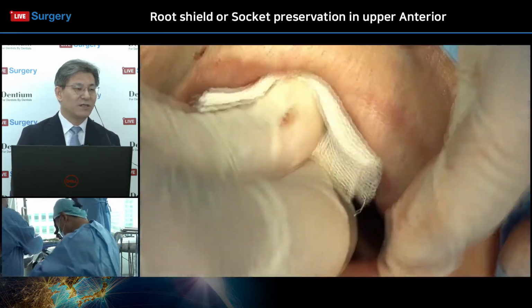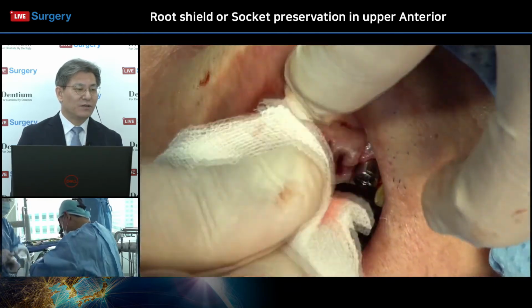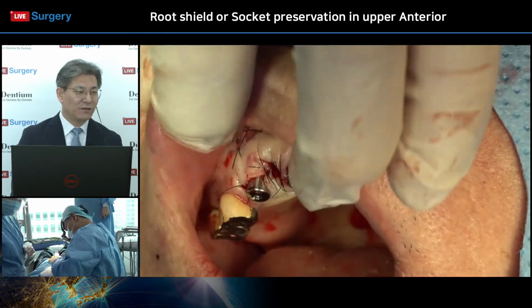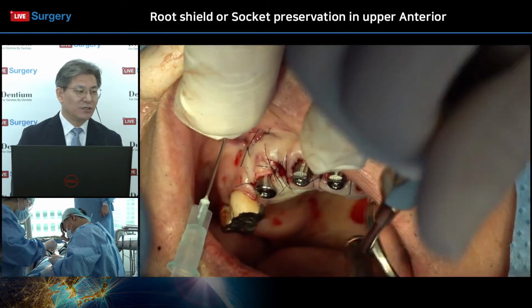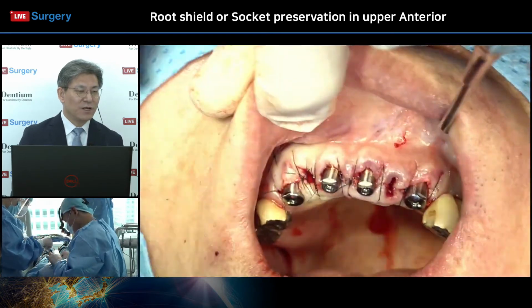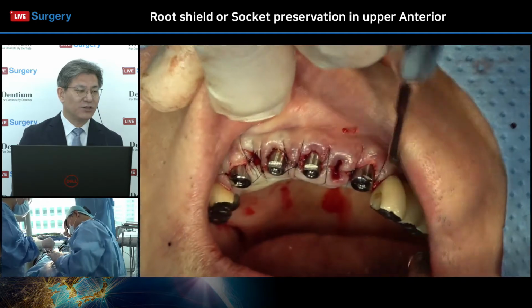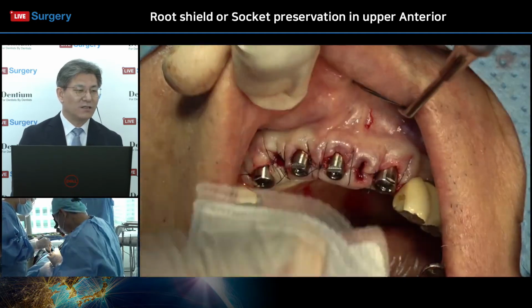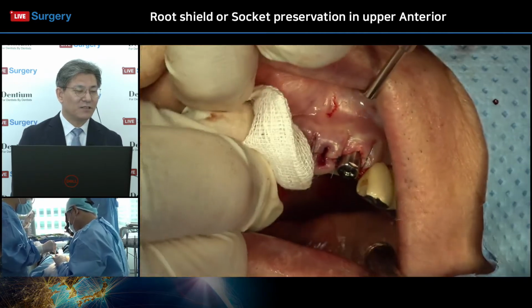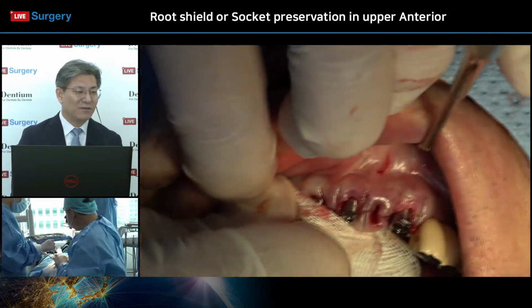Okay, after surgery, we can take an impression, the conventional technique, the bite tray with the rubber impression material. This one is PDRN, to reduce the swelling and for faster soft tissue healing. It is the hidden weapon of Dr. Chung. Yeah, he always has a hidden weapon.